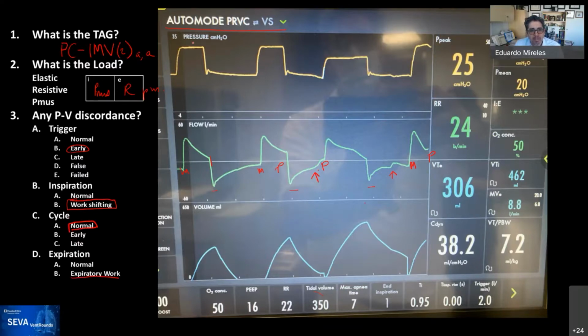Now, a thing that I caught up on, and I want to see if you read it differently, is when the patient was meeting its goal for tidal volume here, everything was good, and then came the pressure supported breath or volume support, as Tim puts there, is pressure support with a volume target. So it's an adaptive targeting scheme.